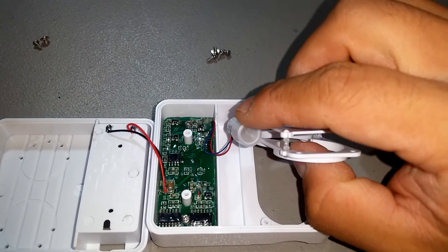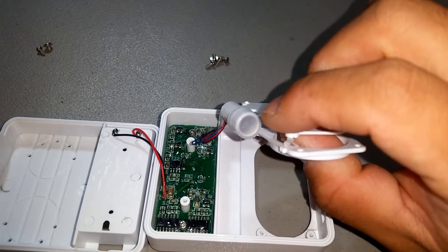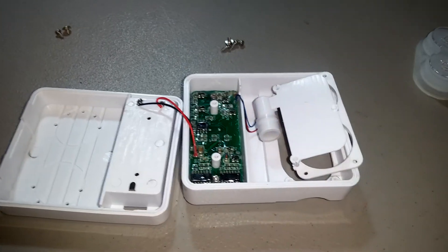This is protected by the cover to prevent water ingress, and the circuit board is also covered. I'll turn it over.